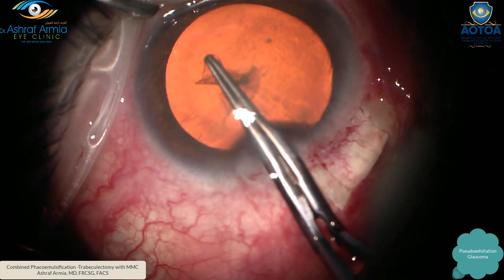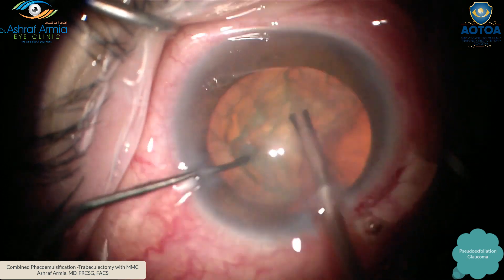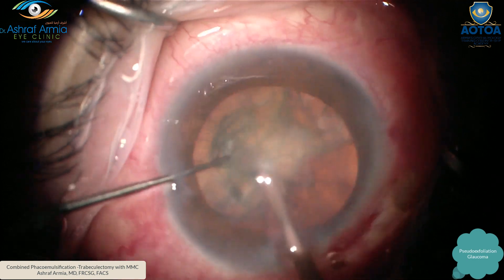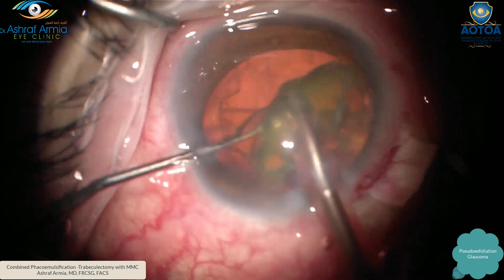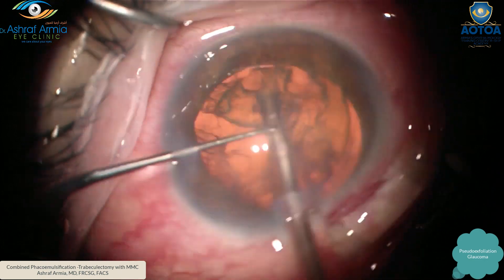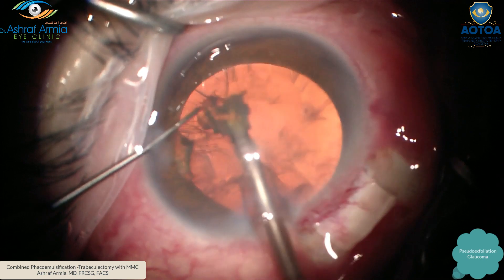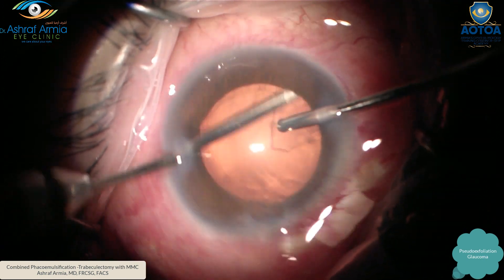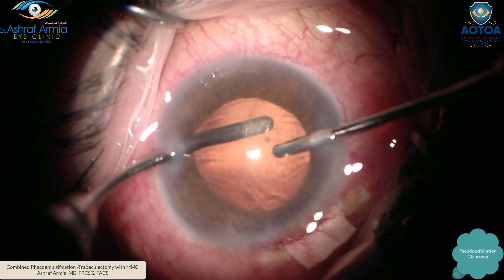As in regular FACO, in these cases the nucleus is grade two to three. I divide the nucleus into two using stop-and-chop, my preferred technique, then remove the nuclear pieces as usual. With the irrigation-aspiration handpiece, it is very important — particularly here — not to leave any cortex, to decrease post-operative inflammation. Clean thoroughly.